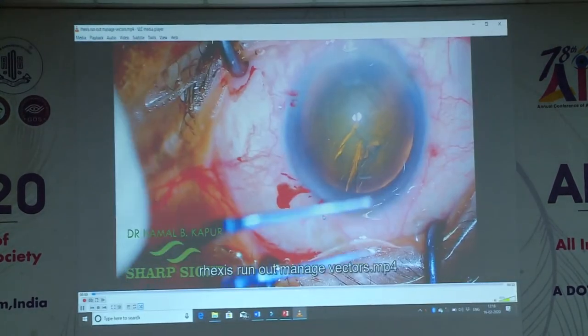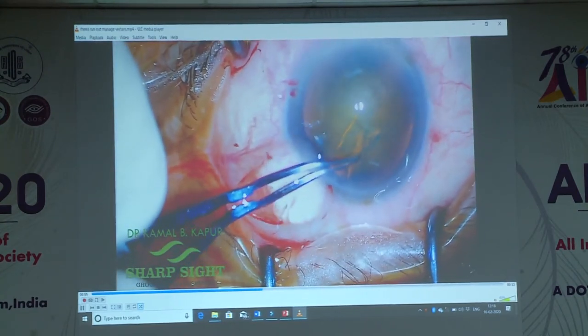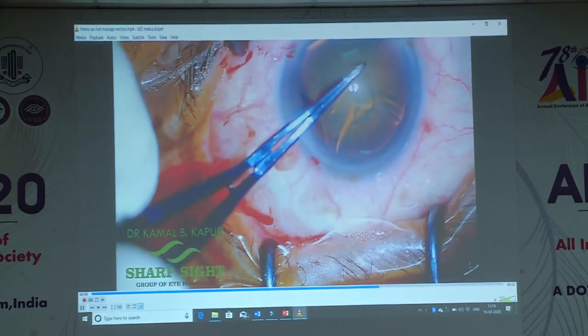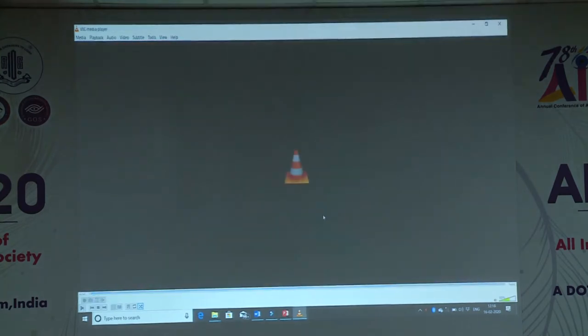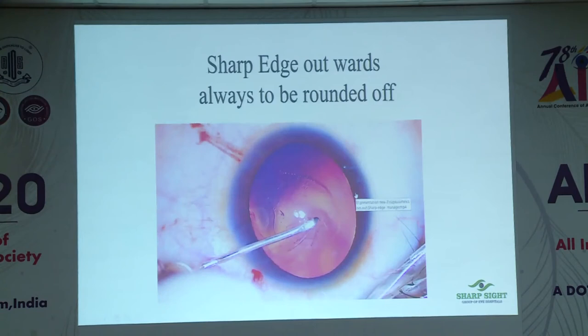This is a very tricky situation: sub-incisional complete peripheral runout. How do you get it back in control? Again a very tricky situation — it is out. I pushed in viscoelastic, there is a good amount of anterior chamber pressure. First radial pressure, and as the rhexis starts extending, I pull it inwards towards the center. Once that is done it comes back in control.